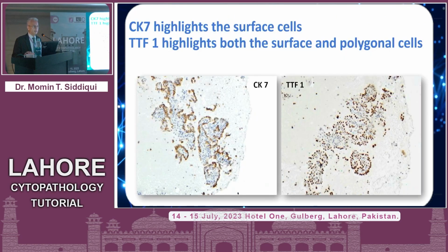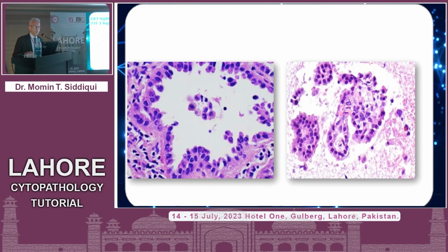And this is another image giving you a characteristic IHC appearance with all the cells picking up TTF1 and CK7 being positive with this outer lining rim, nicely displaying the same cells here as a separate second subset of this dual population noted in this tumor.